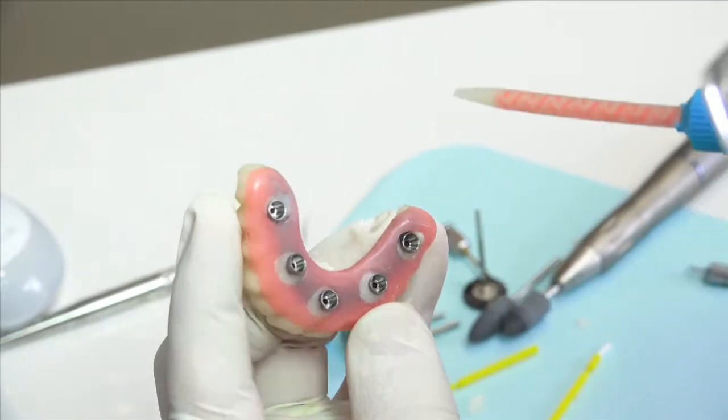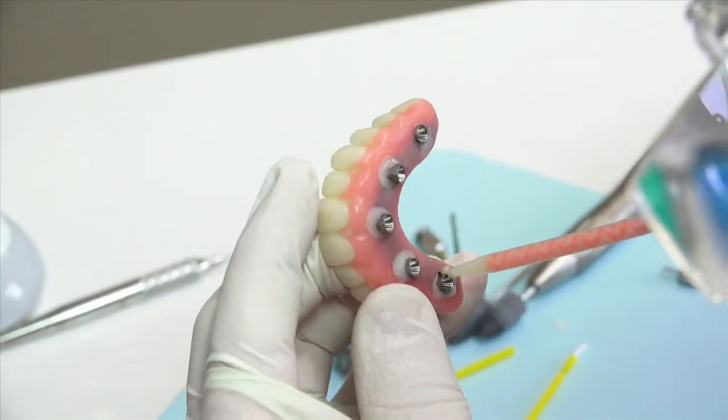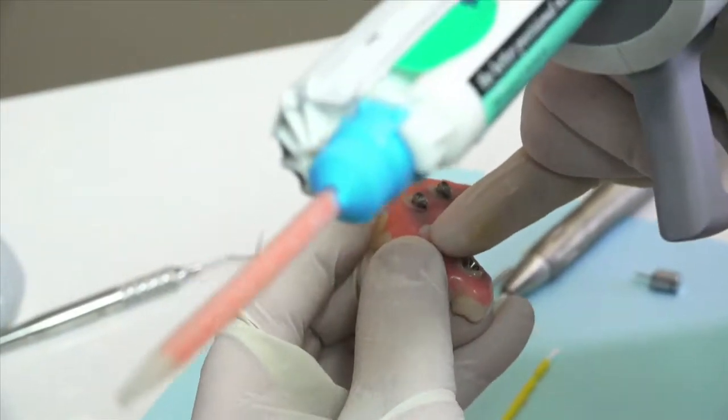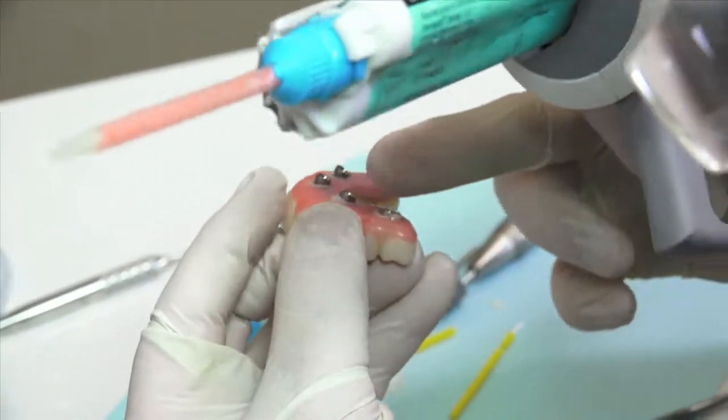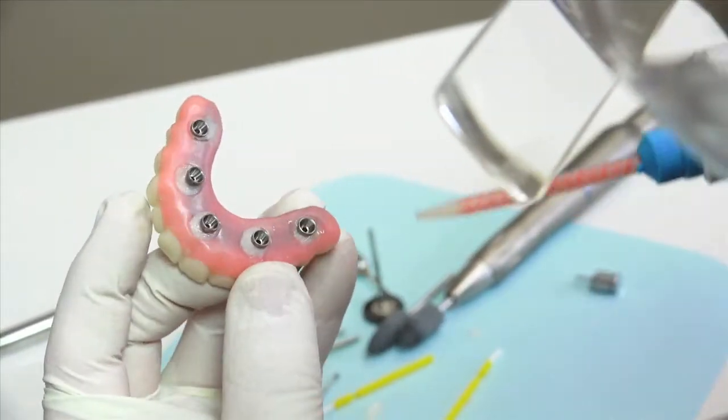Syringe the material into these areas, and prior to the material setting up — or if using a light cure material, prior to light curing — smooth and shape the material as needed. The more precise you are with applying and shaping the material, the more you will be able to reduce the finishing and polishing time.